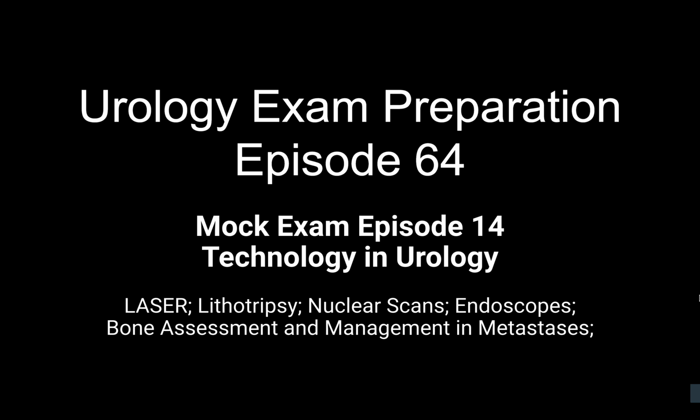Then you mentioned the study on the number of uses for the reusable ureteroendoscope. The main outcome from the study is that the average use of the multiple use flexible ureteroendoscope, the normal fiber optic, is around 15 to 18.